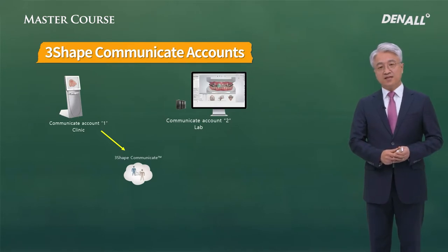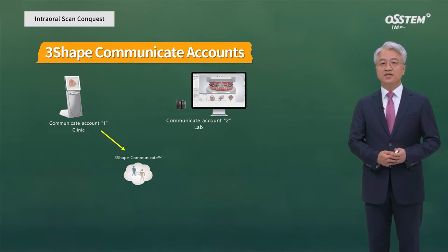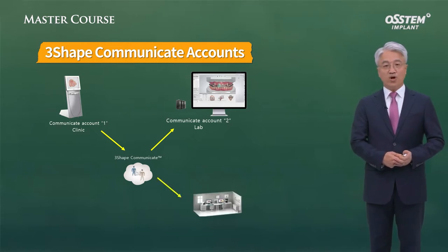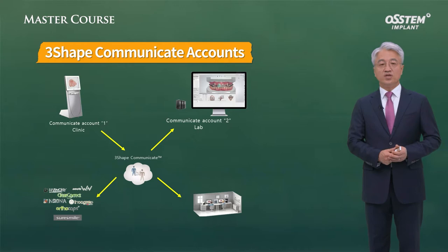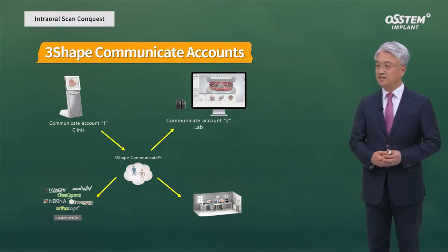How can we utilize these oral scan data? Let's take a look. Let me give you 3Shape as an example. Using the 3Shape server, the scan data is automatically delivered to my dental clinic or other computer softwares. If the internet access is possible, it can be delivered to lab outside our dental clinic, and other third parties may access these information and provide relevant support in terms of orthodontic treatment or surgery.